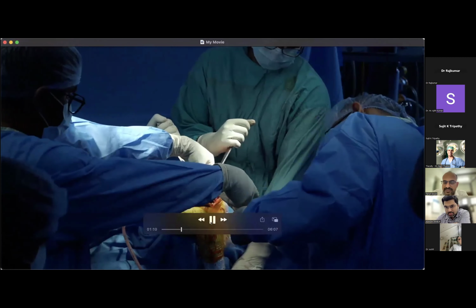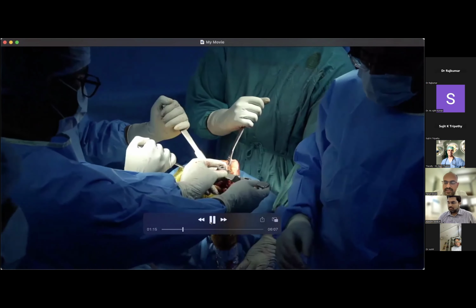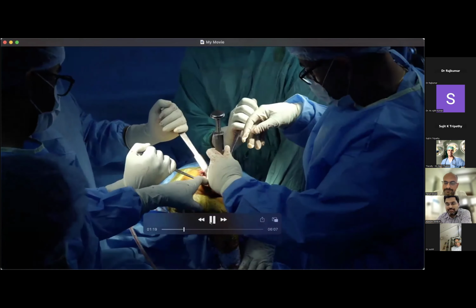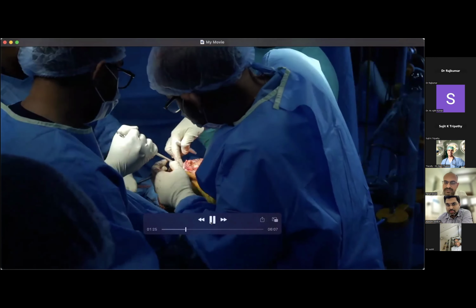And once this is done using the intramedullary system, we have taken a very minimal cut on the tibial side of the tibial plateau, because we don't aim to reach the base of the defect, but we want to reconstruct and restore whatever bone stock is left with us. And we are going to complete the reaming and broaching on the tibial side after the sizing. And in this case, we didn't have to use any offset components.